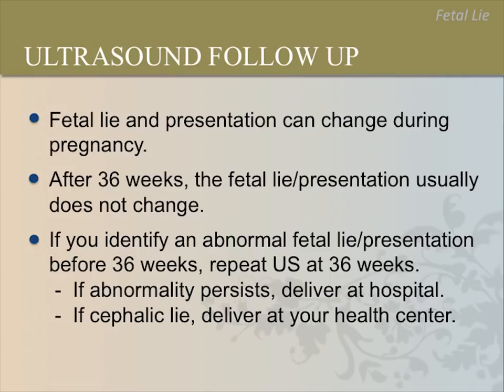It is not uncommon for the fetus to change its lie and presentation up to 4 to 5 weeks before delivery. After 36 weeks, the fetal lie and presentation rarely changes. This is one of the many reasons why accurate fetal dating is so important in order to mark these weeks correctly.